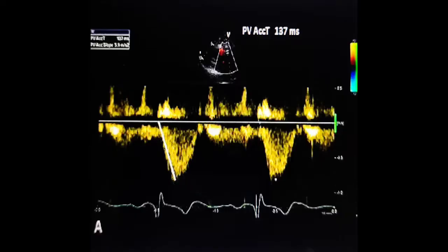Mean pulmonary arterial pressure can also be estimated from RVOT acceleration time. As PA pressure increases, resistance to blood flow from the RV into the pulmonary artery increases, resulting in shortening of RVOT acceleration time. Mid-systolic notching may also be seen in pulmonary hypertension. If RVOT acceleration time is more than 130 milliseconds, that is normal; if less than 100 milliseconds, that indicates pulmonary arterial hypertension.